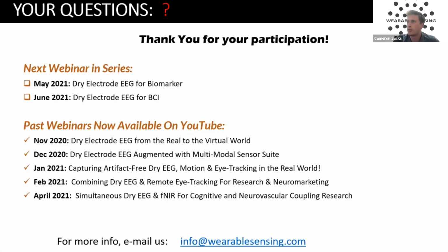Awesome. Next question, is it possible to compare dry EEG and fNIR on any kind of source reconstruction approach? Oh, great question. Thank you for that. Typically to do source reconstruction, most people agree that you need at least 19 electrodes, preferably more. With 19 electrodes, you can do sLORETA, or you can do BESA, source localization, and a few other methods. However, with this headset we only have 8 channels, 8 sensors, due to the size of it on the head.